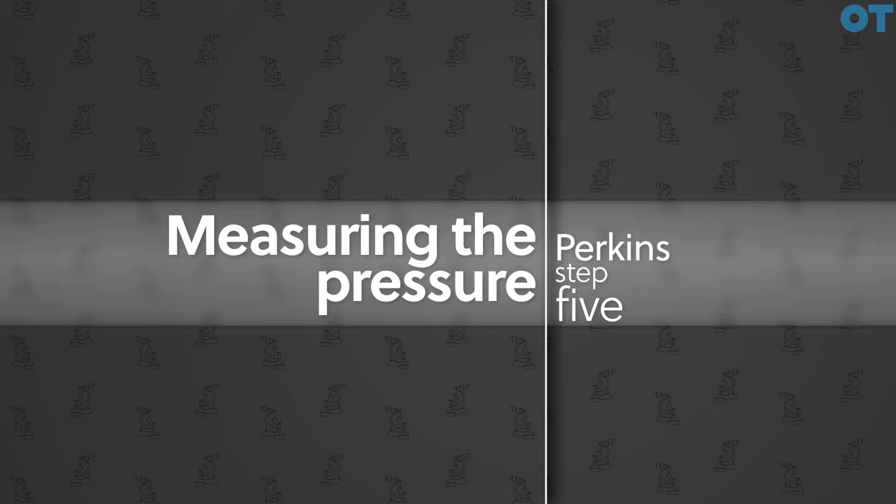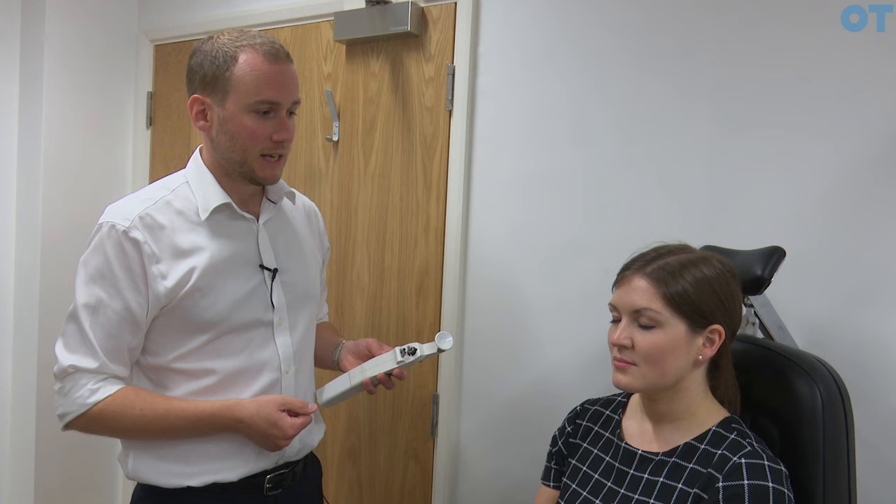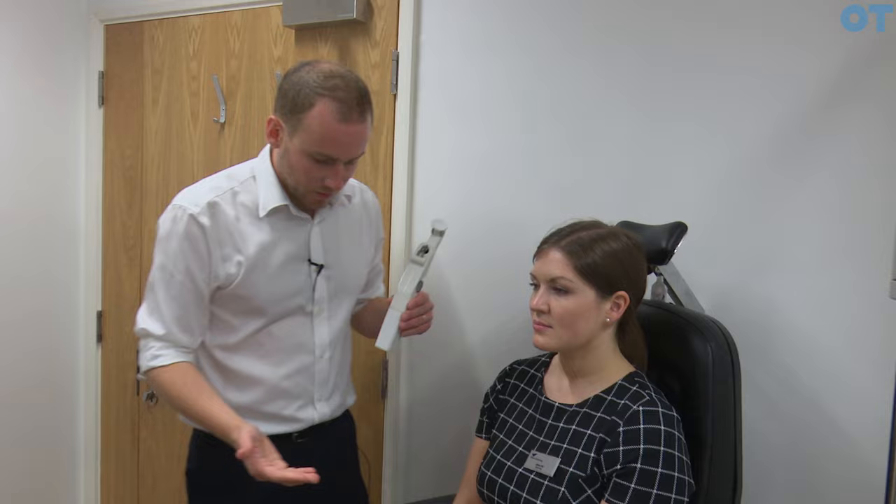Whilst the patient is blinking we can set up the instrument. When using a Perkins tonometer we must make sure that there are no bags or elevation devices for the chair in our way — we don't want the patient or the practitioner to be moving whilst we're taking the measurement. Once we've achieved that, we make sure the patient is at the appropriate height, introduce the probe into the instrument, and make sure the probe is running horizontally by looking down the probe and rotating until we can see that the prism inside is running horizontally.